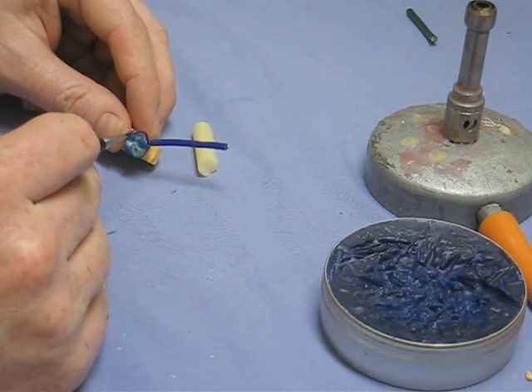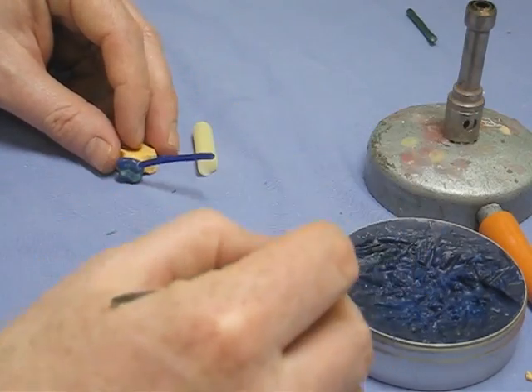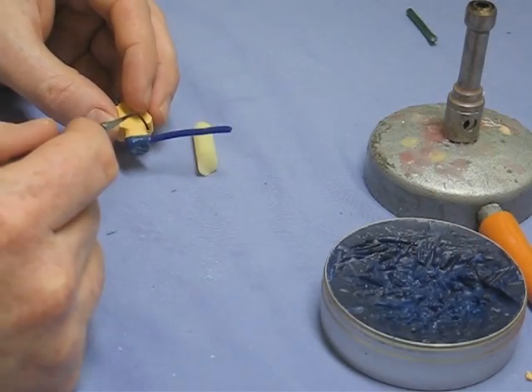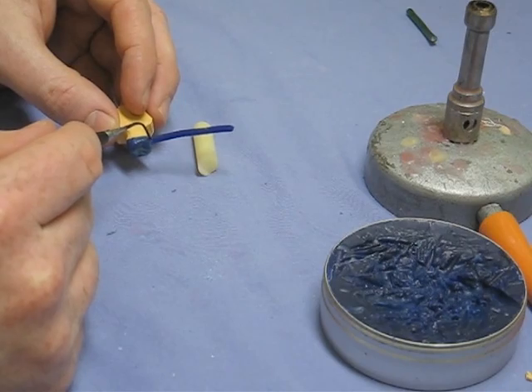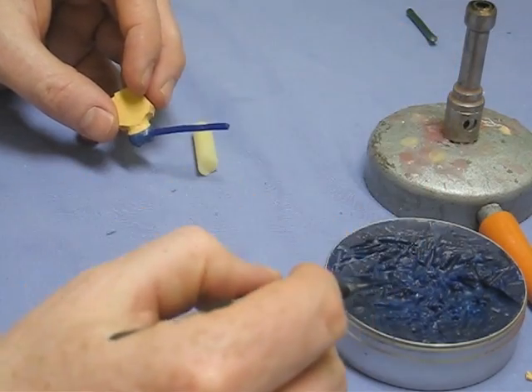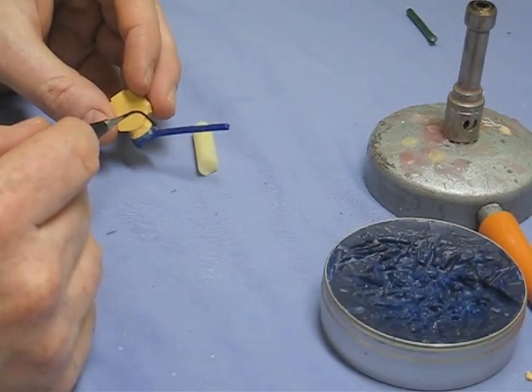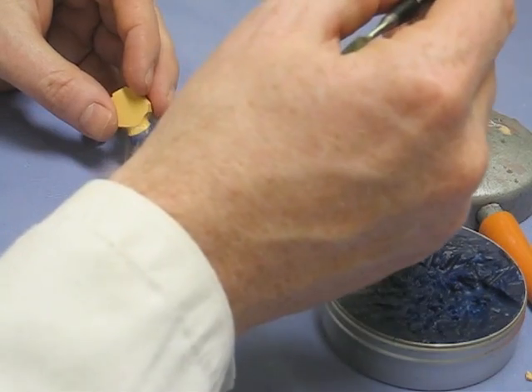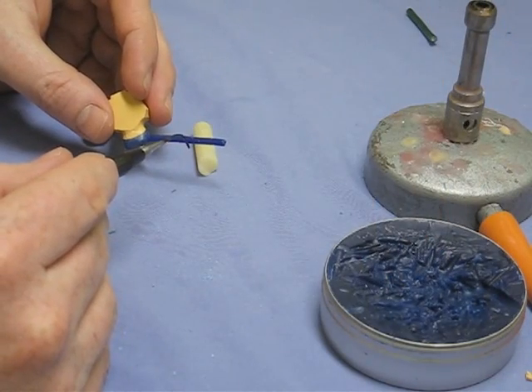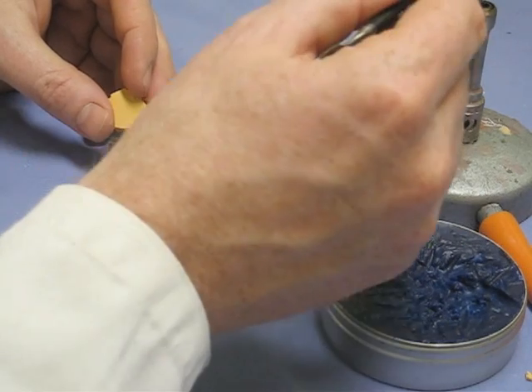So we're just making the wax nice and flush into the wax pattern so we don't have any creases in the wax because they'll come out as positives in the refractory material which are likely to break off when the metal gets shot in.